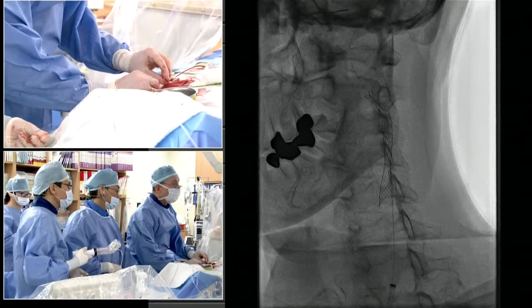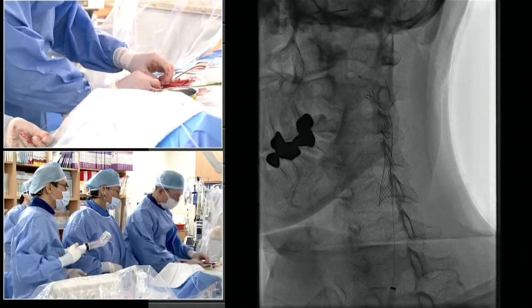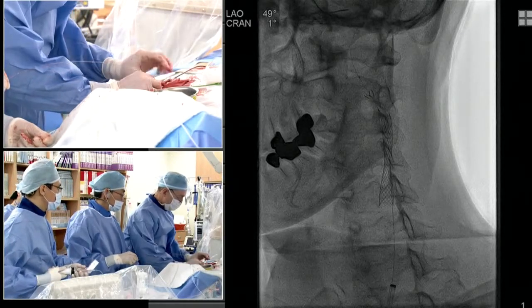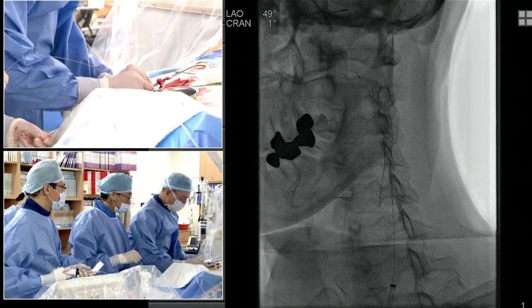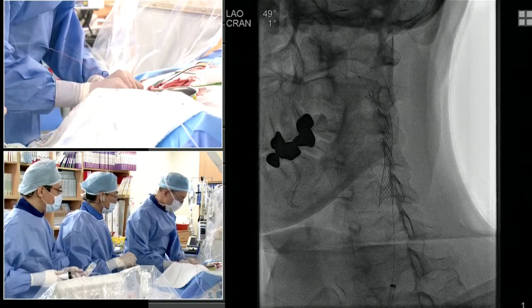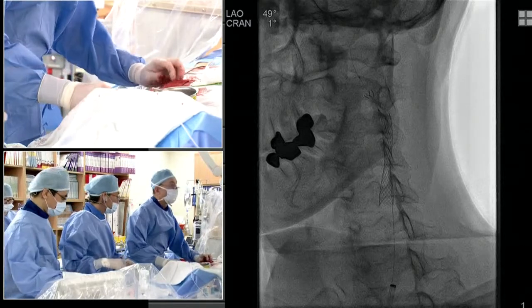And so I have that in mind as I'm going for what to get post-procedure. And in addition, as you mentioned, sometimes your highest risk of stroke is right now. So I think the overall rate of restenosis will certainly be acceptable, and it's worthwhile avoiding a stroke at all costs.